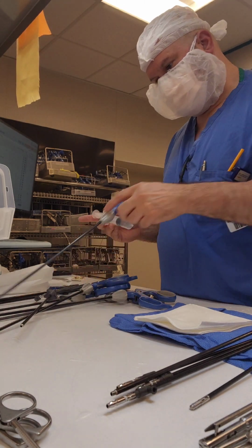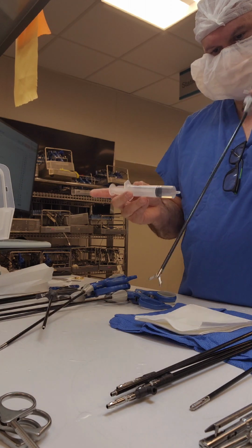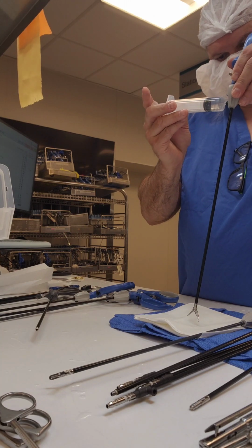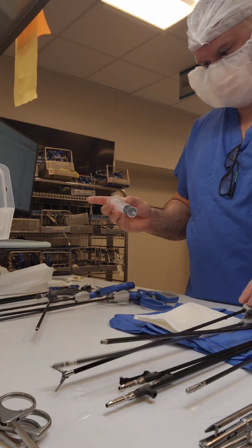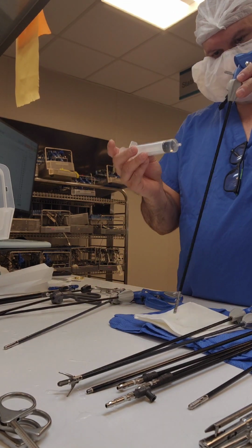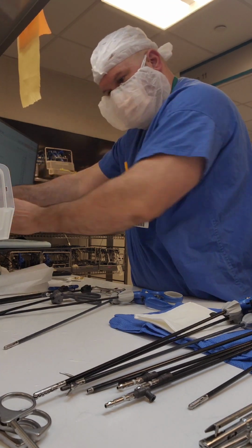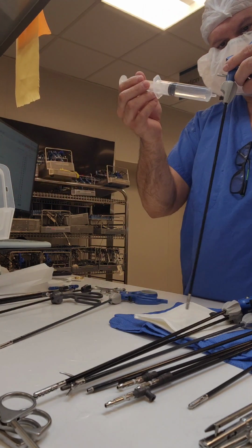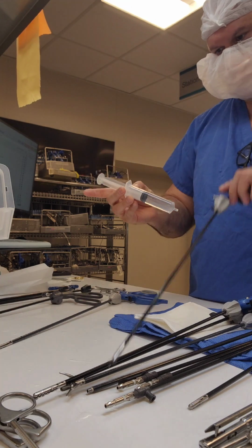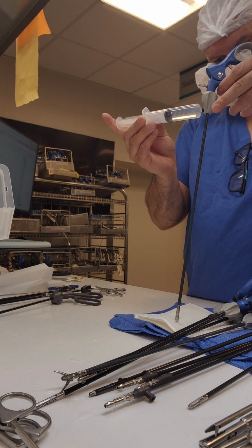All my single assembled instruments, I give a quick flush. Now, you notice I'm not using that much water, right? It just takes a little bit to see if there's anything in there. This is where the trust factor comes in. For the single unit instruments, you're hoping that decon did the right thing and cleaned them completely, because there's no way to verify whether they're clean. I can't get a borescope down there. I can't get a testing kit down there. I can't get a brush down there. I just have to flush that with some sterile water to make sure that nothing comes out of there.